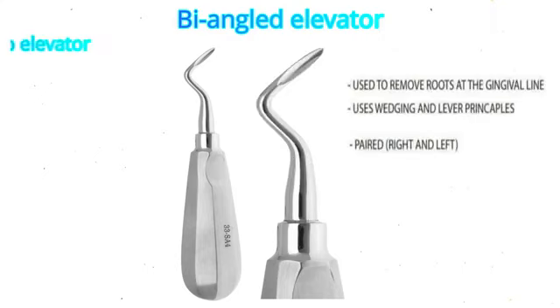The curved apexo is the most common one. It is used for removing apical fragments of root deeply present in the socket of the lower jaw, especially molars. It is also used instead of the straight elevator in both upper and lower posterior teeth since it's very similar to the straight apexo but generates less force due to the angulation.